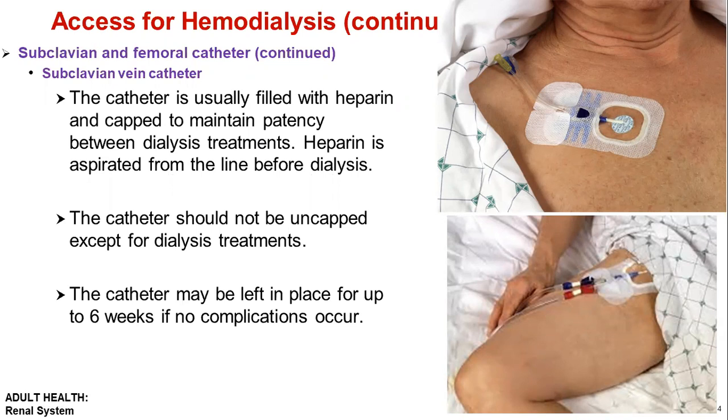The catheter should not be uncapped except for dialysis treatment, right? Very important, so it can prevent infection. The catheter may be left in place for up to 6 weeks if there is no sign or symptom of infection or inflammation.